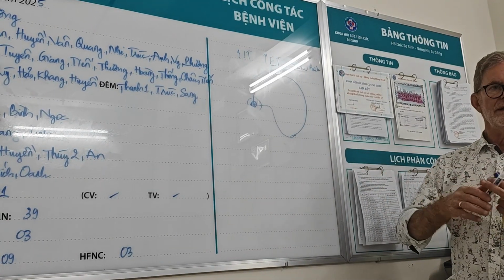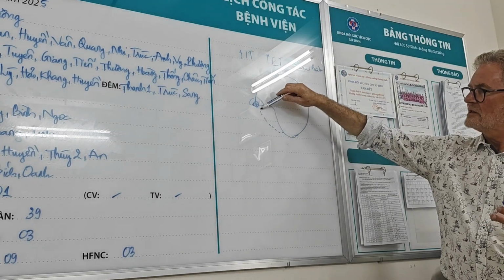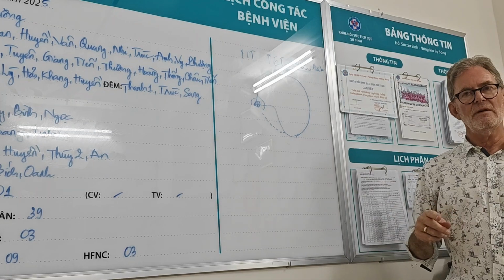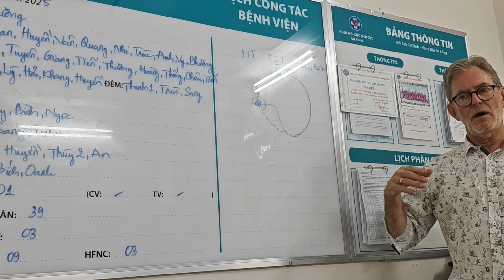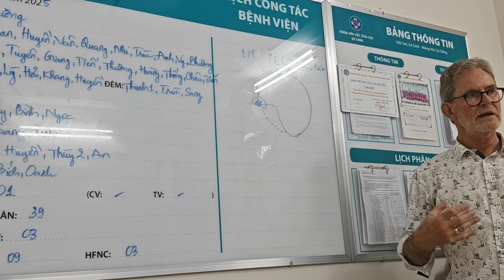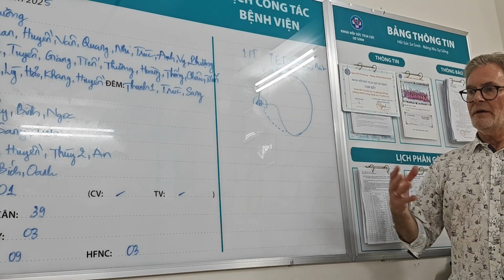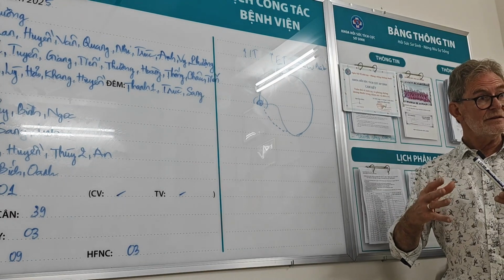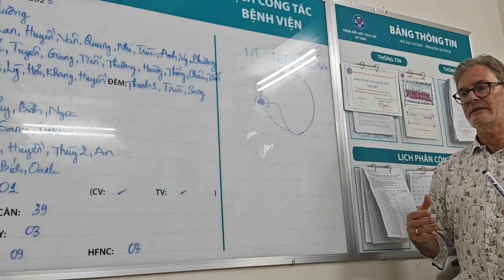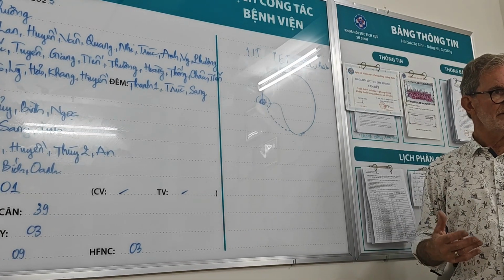And what you do is you increase the PEEP bit by bit until you correct that. And often what you'll find is that by increasing the PEEP and splinting those airways open, the lung starts to deflate, even though you're on a higher PEEP. And gas exchange is better, oxygenation is better.